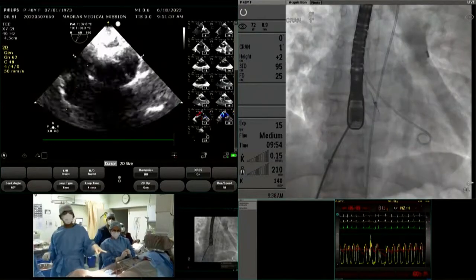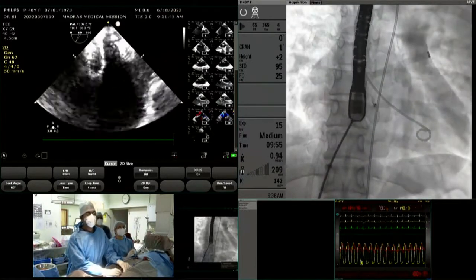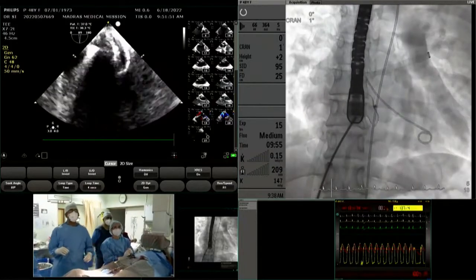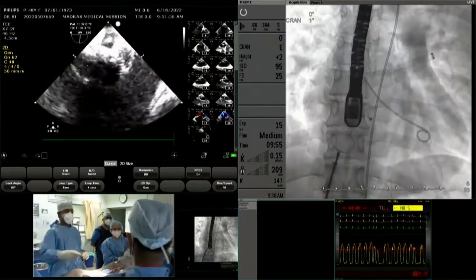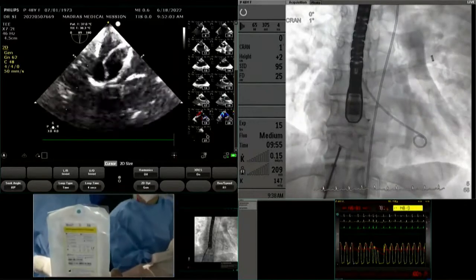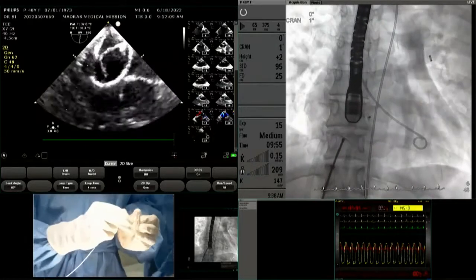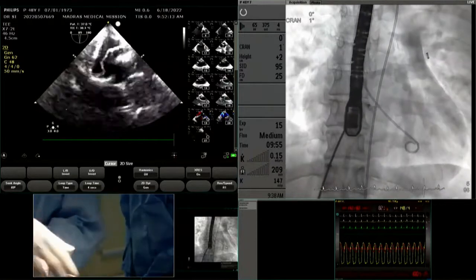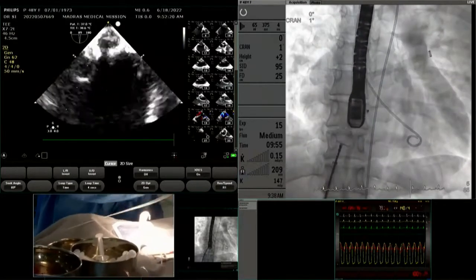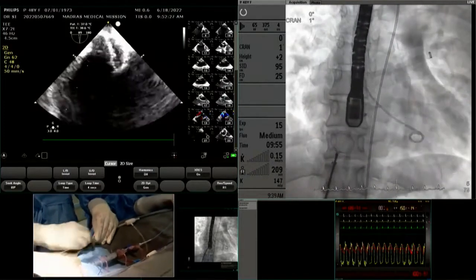Pramod, check on the device. Probably you can take the other device simultaneously, which you have also demonstrated in some of the live workshops in the past. The intention in a small device versus a large device is that I try to sandwich the large device. So here the intention will be to get the LA disc of the larger device on the left side and the RA disc of the large device on the right side. So I'm now getting the second. Pramod, you are happy about the edges? Yes, sir.